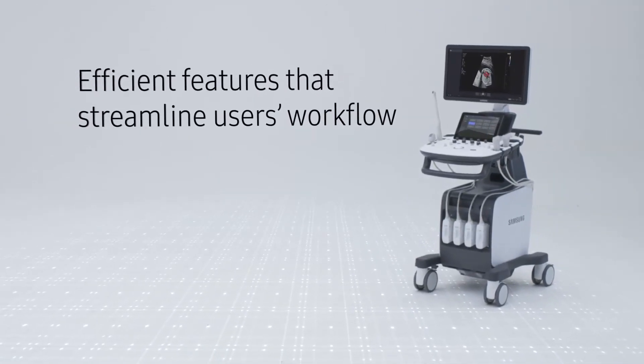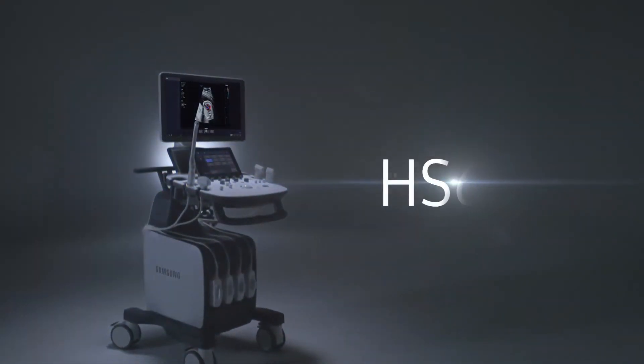Now is the time to let HS60 help you focus on your needs.